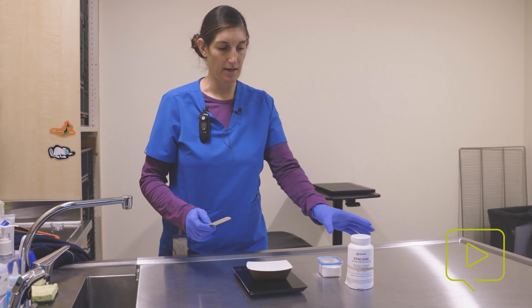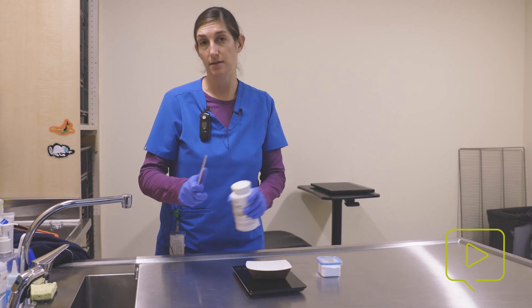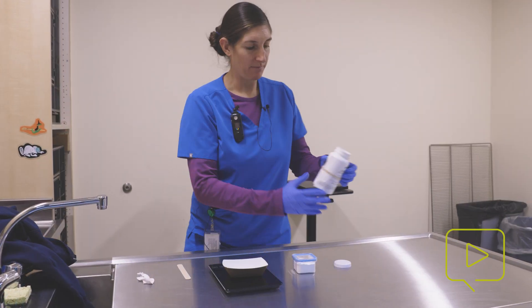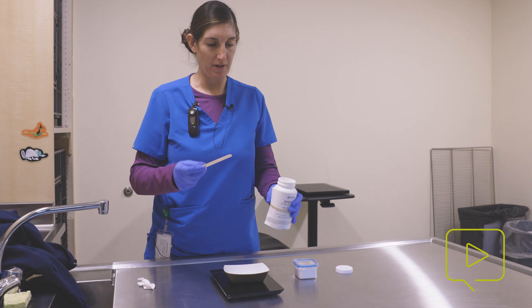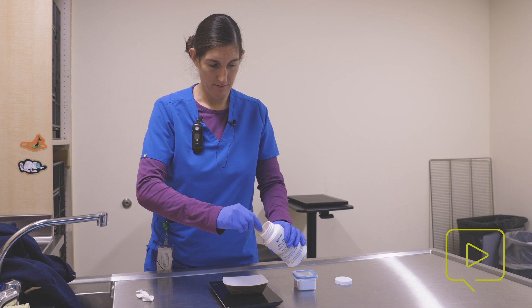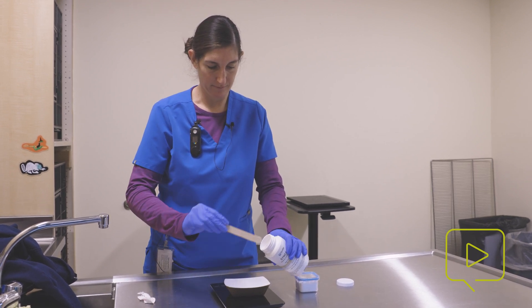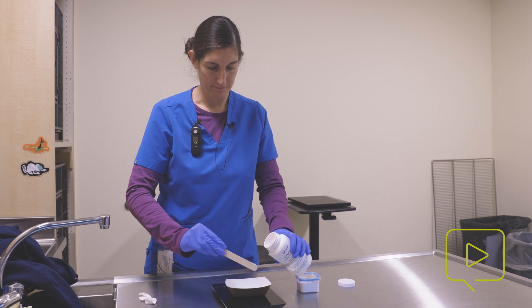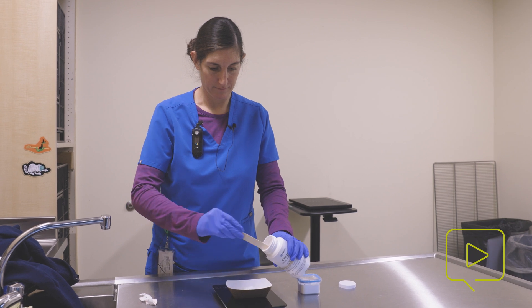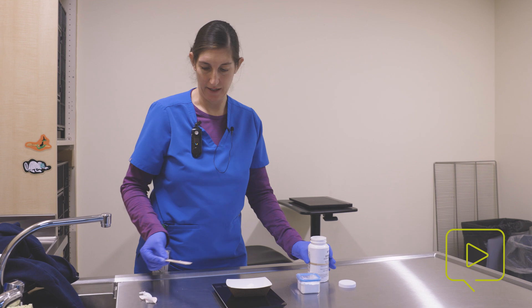What I'm looking for is 10 grams of the tricaine in order to create a stock anesthesia solution that we'll use to anesthetize our fish today. So I'm going to measure out 10 grams of the tricaine. All right, so that's 10 grams of tricaine.